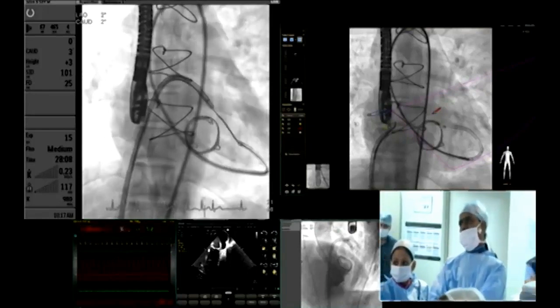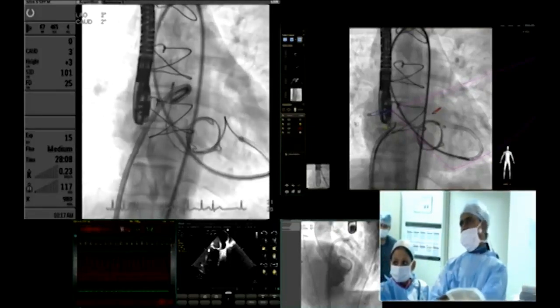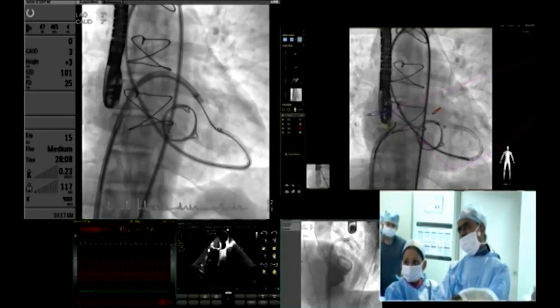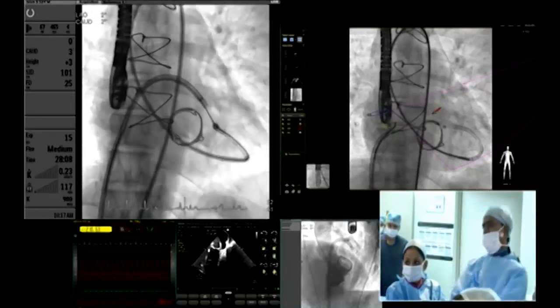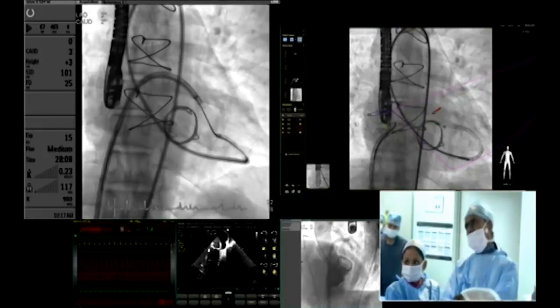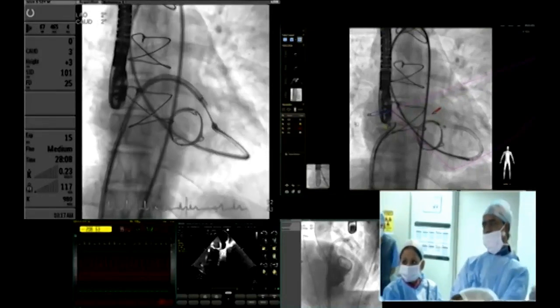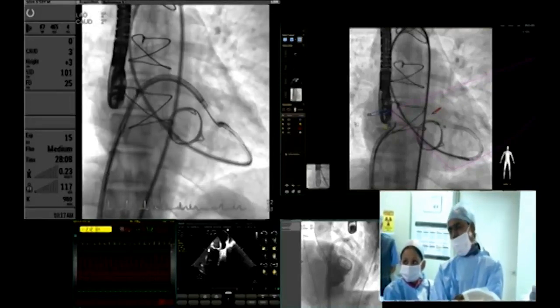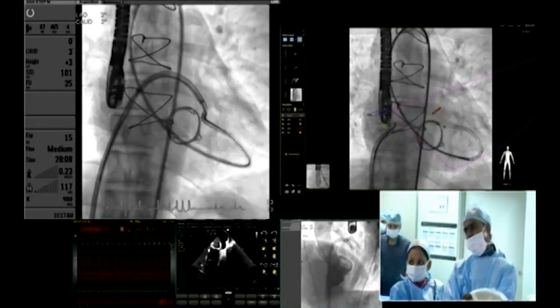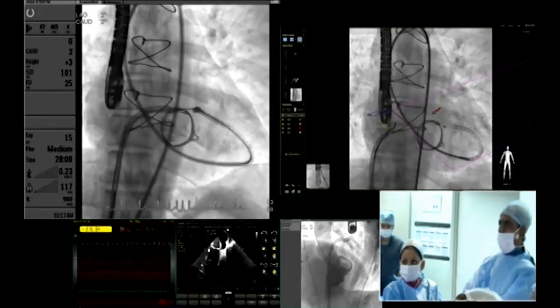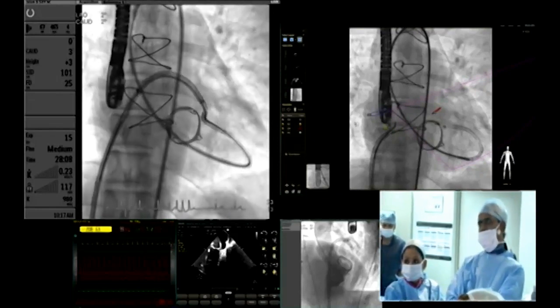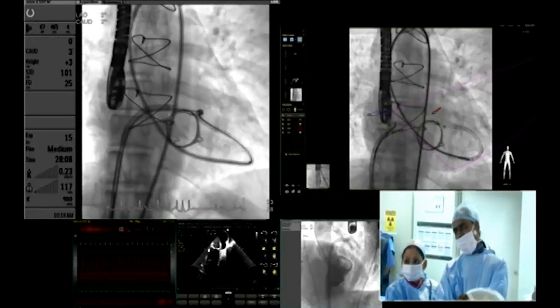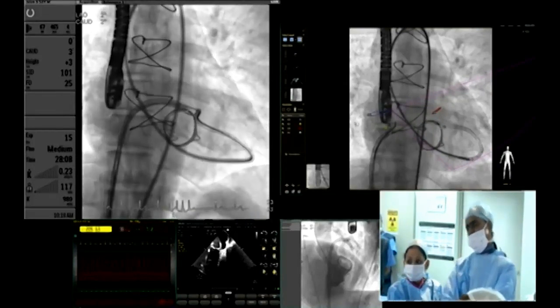There were some problems getting the Agilis sheath across the mitral paravalvular leak. We decided to take a shuttle sheath from the arterial side because the angulation to cross from the atrial side was a little tough for the Agilis sheath. The Agilis is a braided sheath and has a larger profile. We probably could have crossed it with a normal Cook Mullins sheath which is much lower in profile. However, since the Agilis was finding it difficult to cross, we decided to go retrograde.